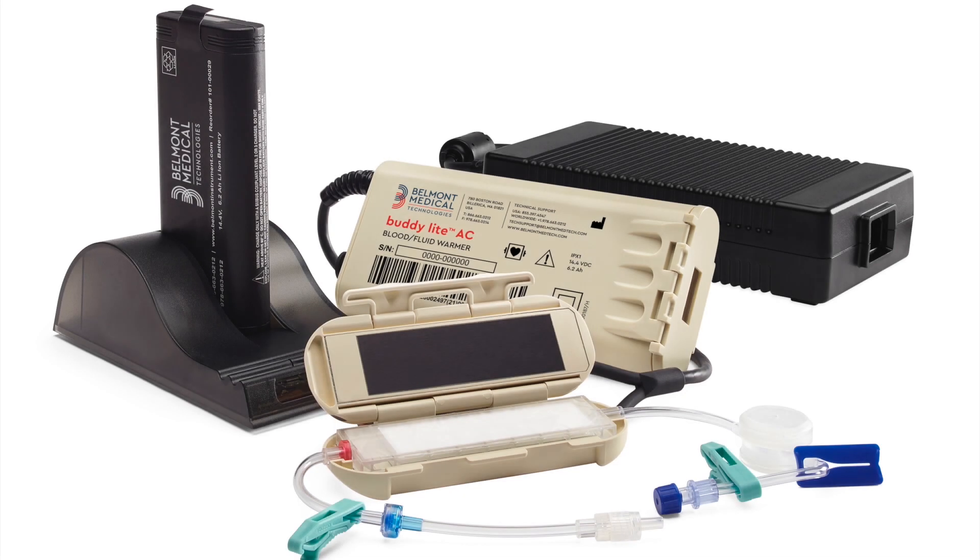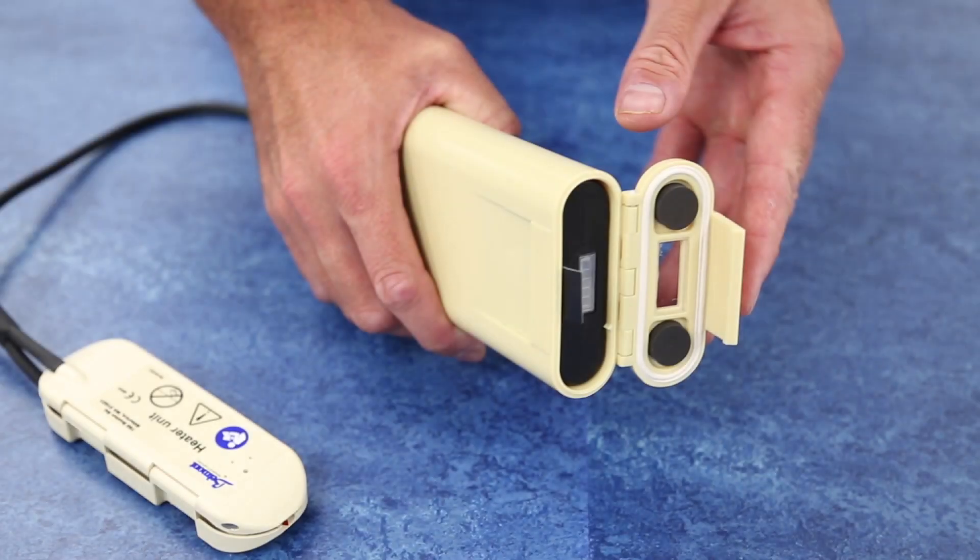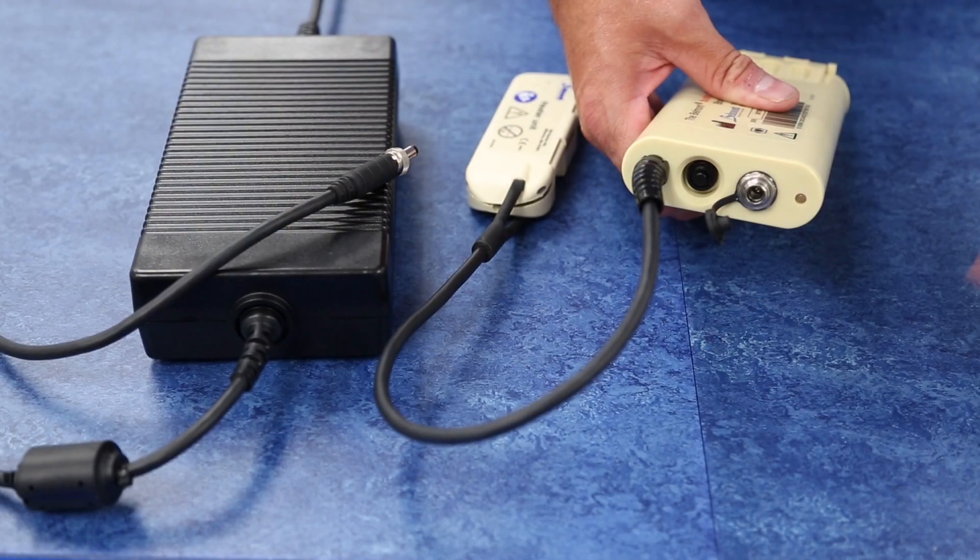The Buddy Light AC is designed for extended use of the system anywhere AC power is available. The internal battery is isolated from the AC power source, conserving battery power and protecting against overcharging. The system can easily switch from AC to battery power, eliminating any interruption in fluid administration.